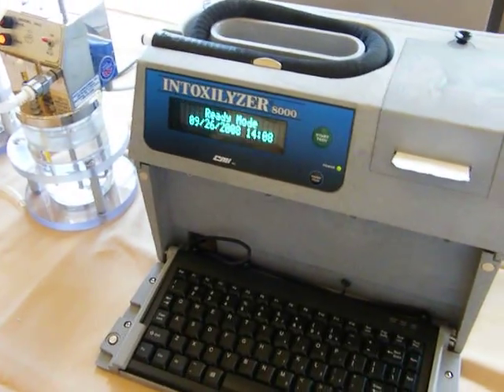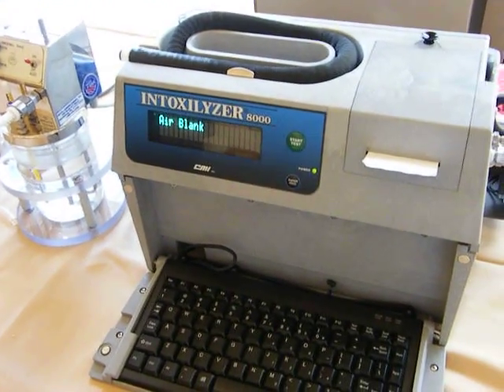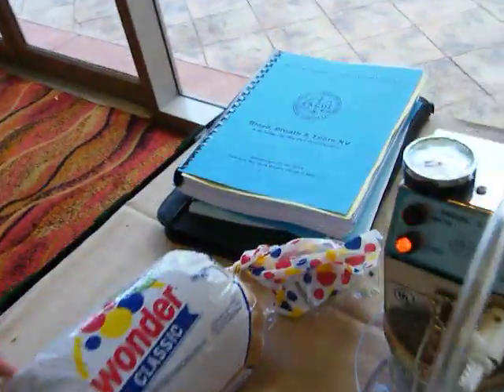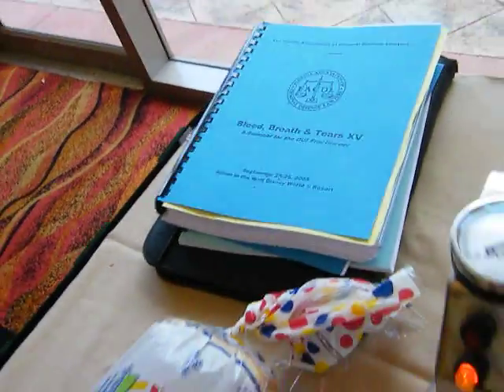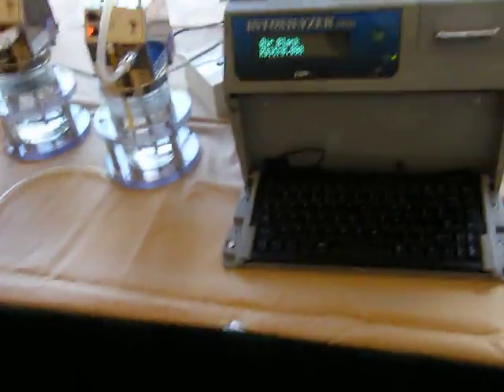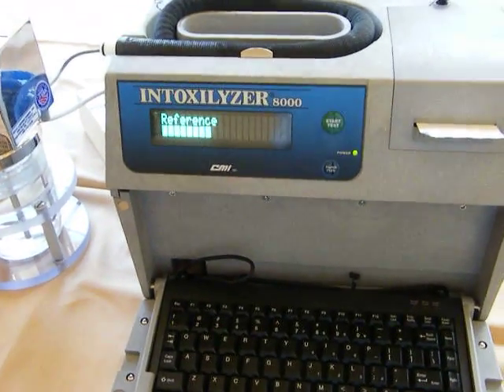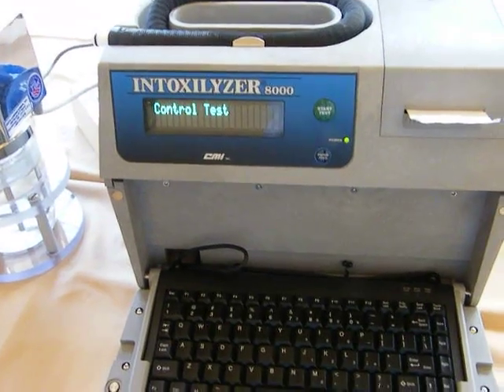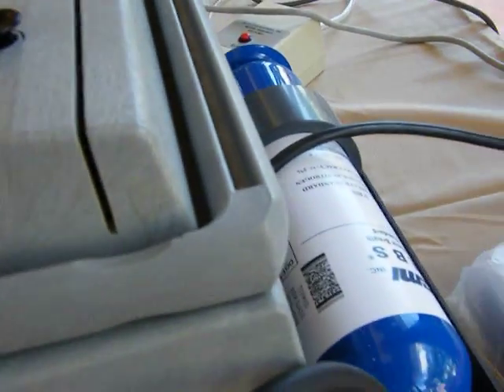I don't want you to blow hard again so I can get it on videotape. Now we're just going to go through his prompts. And is that bread fresh, Charles? Mm-hmm. Marla just went out and bought us that Wonder Bread. Here's some of the simulators. We are at the blood, breath, and tears seminar in Orlando. The machine just ran an air blank. It's sitting at a zero reference point. Now it's going to do a control test with a dry gas standard, which is located in the back of the machine.